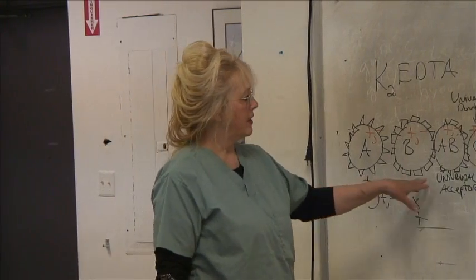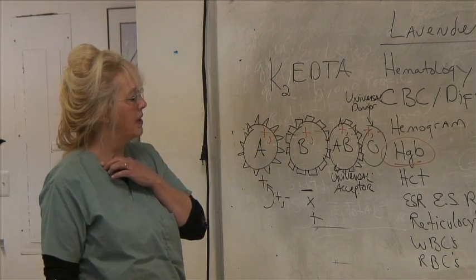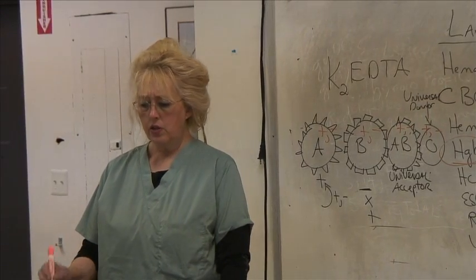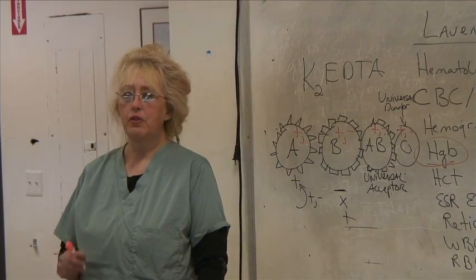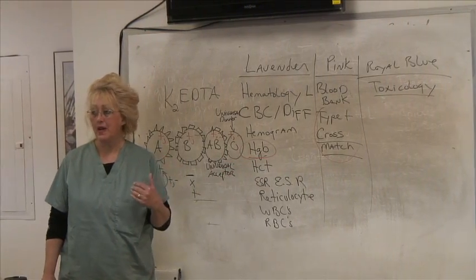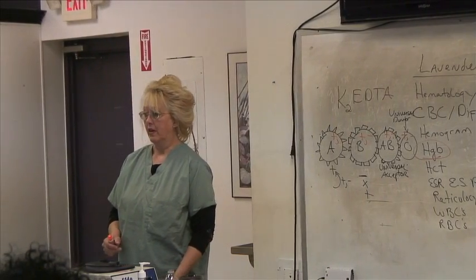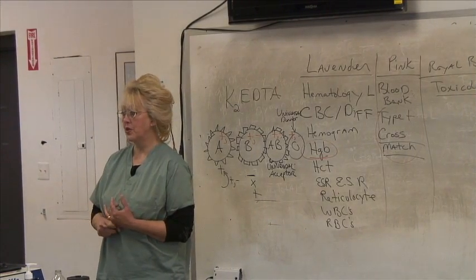So knowing, and you read more about this on the phlebotomy website when you log in to the course, you'll read more about blood typing. I guess the most important thing in showing you that hemoglobin and type and cross match is usually the first thing that we do before we transfuse blood or blood products, to realize that whenever you draw blood from anyone, you must identify the patient and you must label the blood after you've drawn it at the bedside, which is why if I have a patient who has to have a type and cross match and a hemoglobin drawn, I'll draw it myself. Because, to be honest with you, I'm kind of skeptical about having the phlebotomist actually draw the blood, okay? And you can understand, because only nurses and doctors can transfuse blood in the state of Michigan, not LPNs. Has to be a registered nurse or a physician.